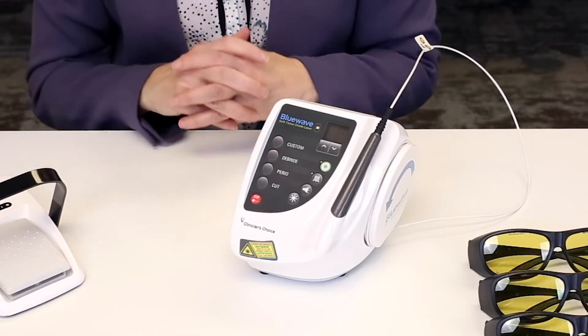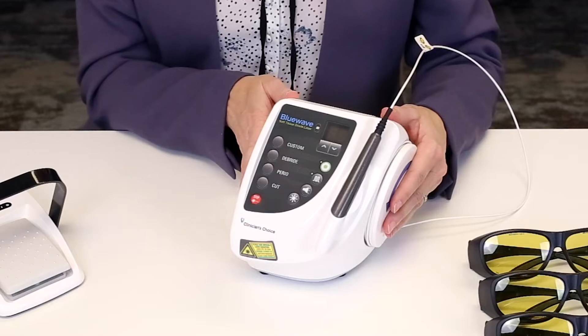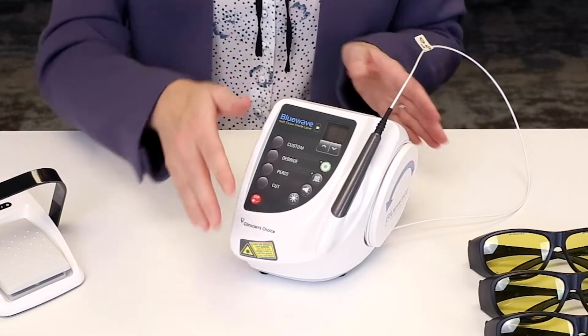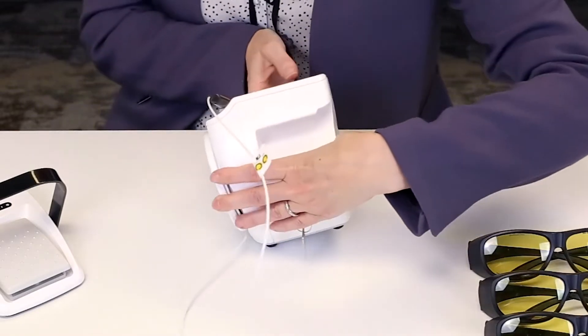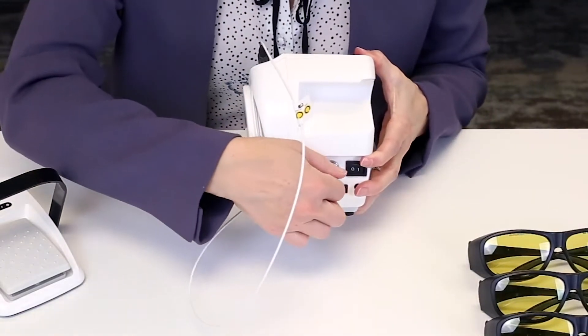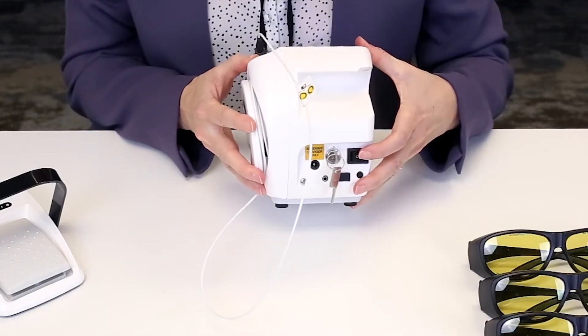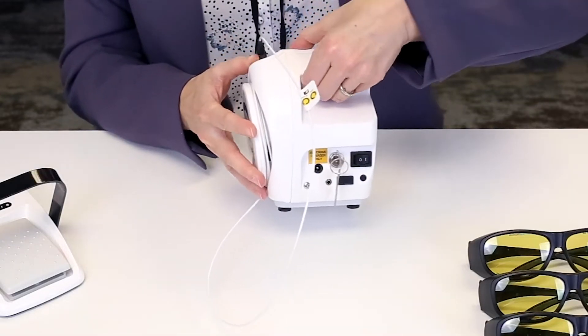Next we're going to walk through the buttons on the BlueWave interface. The first step is to turn the unit on. Turn it on by simply rotating the key and flipping the switch to the on position. You'll hear a beep when the unit starts up and it's ready to be used.